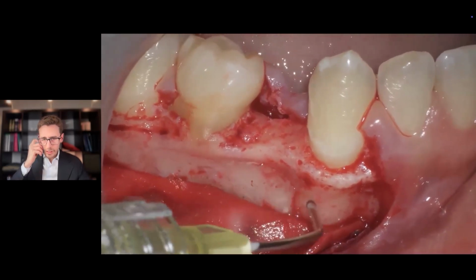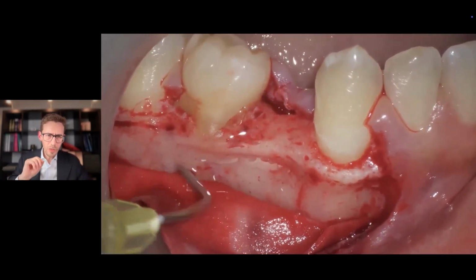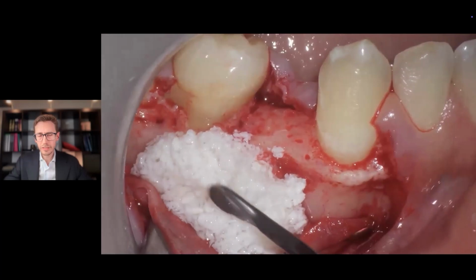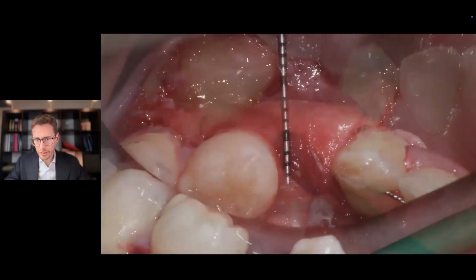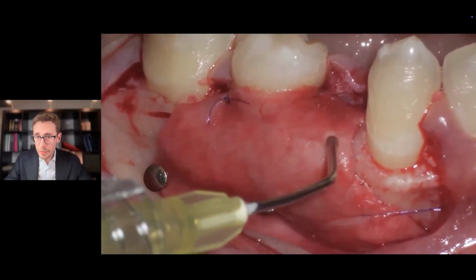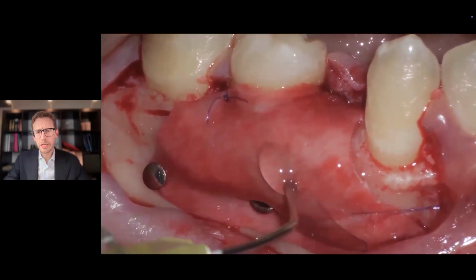So you see, the very first application, in a very small amount, is painted on top of the receiving bone in order to target the viable cells in the receiving site. Bio-Oss is applied without being mixed with RegenFast. It's simply slightly hydrated with saline, as we usually do. This doesn't impair in any way the primary stability of the system.